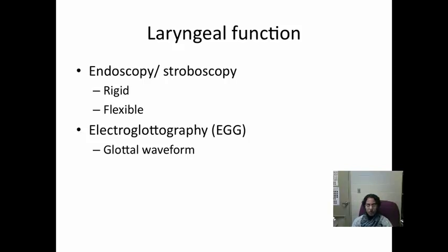The next thing video stroboscopy does is help us understand the vibratory characteristics, the vibratory properties of the vocal folds. It tells us how the mucosa of the vocal folds is. Is it nice, moist, good vocal folds that help easy movement, or does it have thick mucus on the vocal folds, making it hard for them to move?